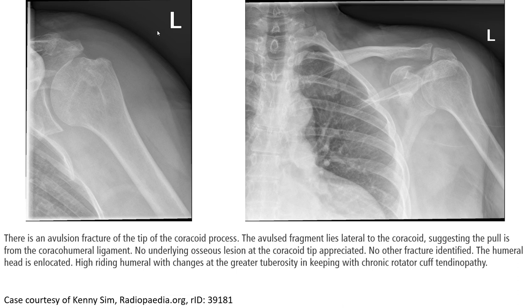Another example of a coracoid fracture. This is an avulsion fracture of the tip of the coracoid process. The avulsion fragment lies lateral to the coracoid, suggesting a pull from the coracohumeral ligament. No other fracture is identified. The humeral head is located. High-riding humerus and changes of the greater tuberosity are in keeping with chronic rotator cuff tendinopathy.